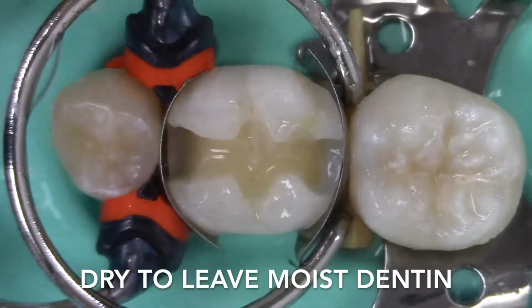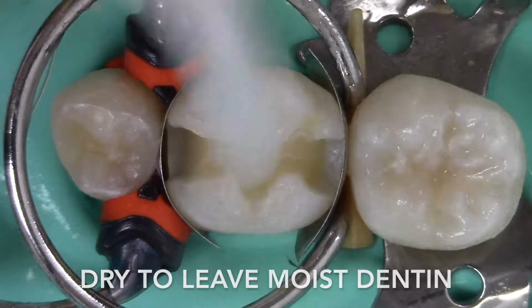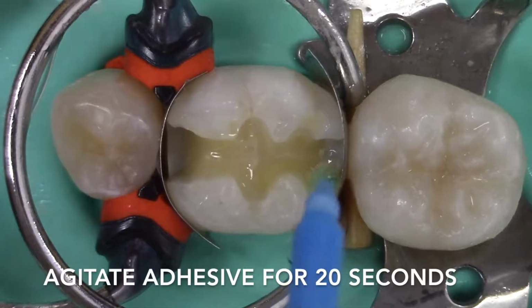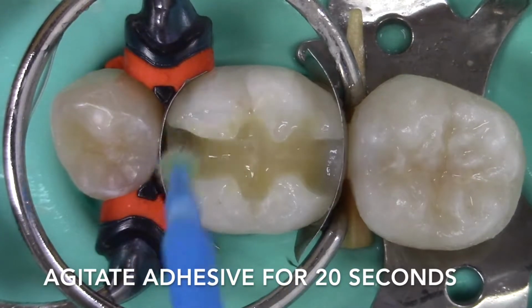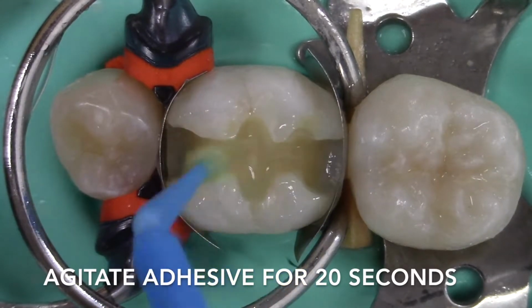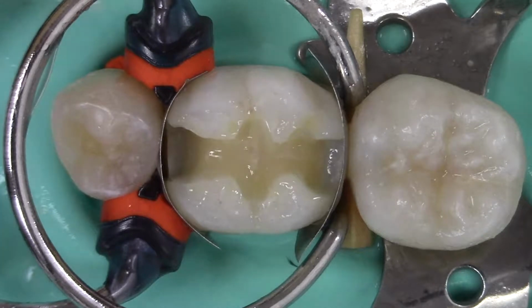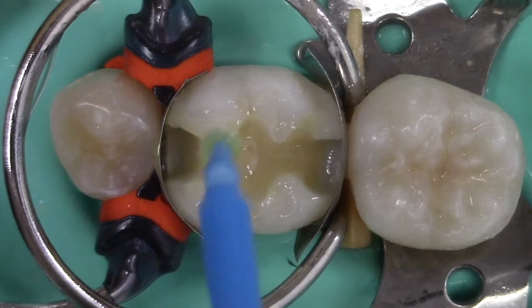It's important not to over dry the dentin, particularly in the total etch mode, as it may prevent the formation of a hybrid layer. Adhesive is applied to the preparation for 20 seconds. It is important to scrub the adhesive into the preparation and make sure that the entire surface of the preparation is coated. If the preparation is too narrow for a microbrush, a bender brush may be used to apply the adhesive.